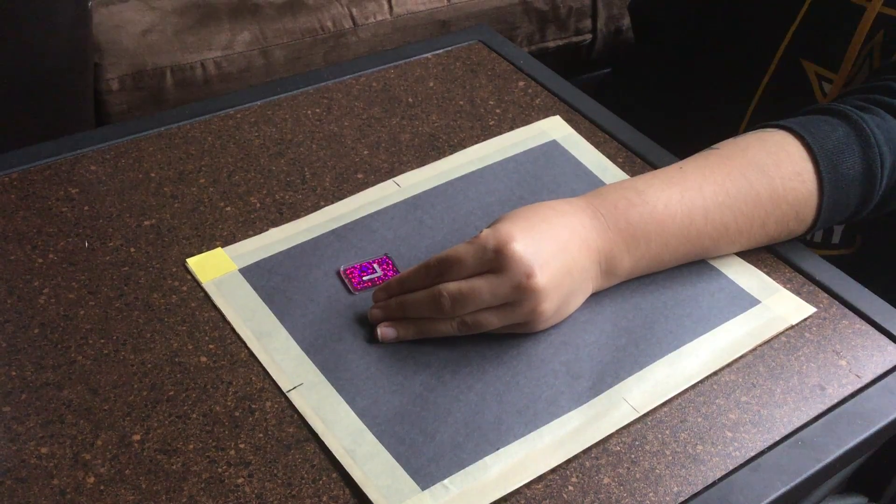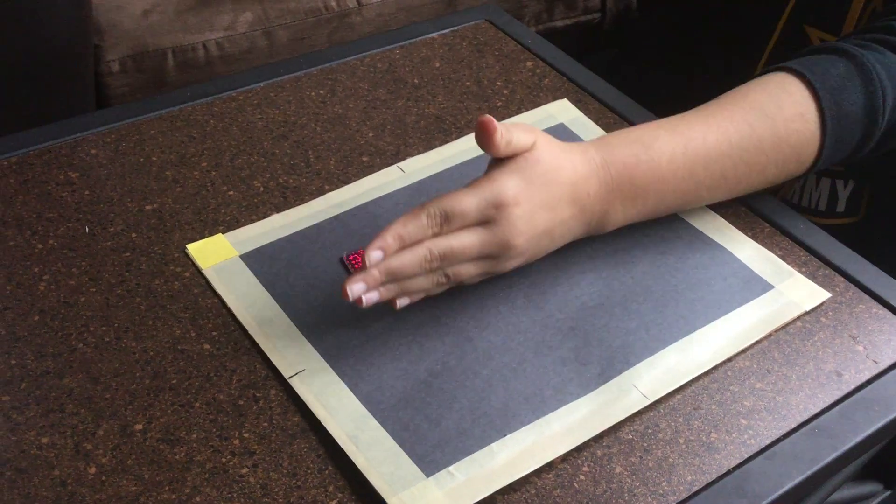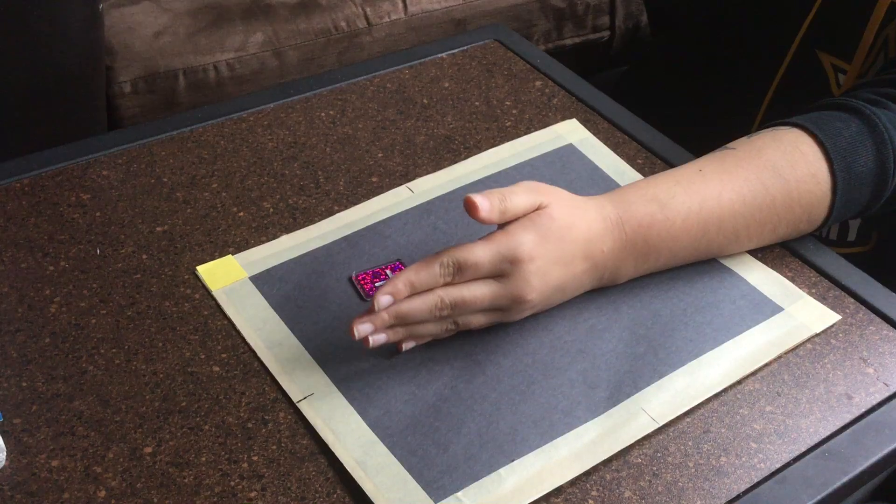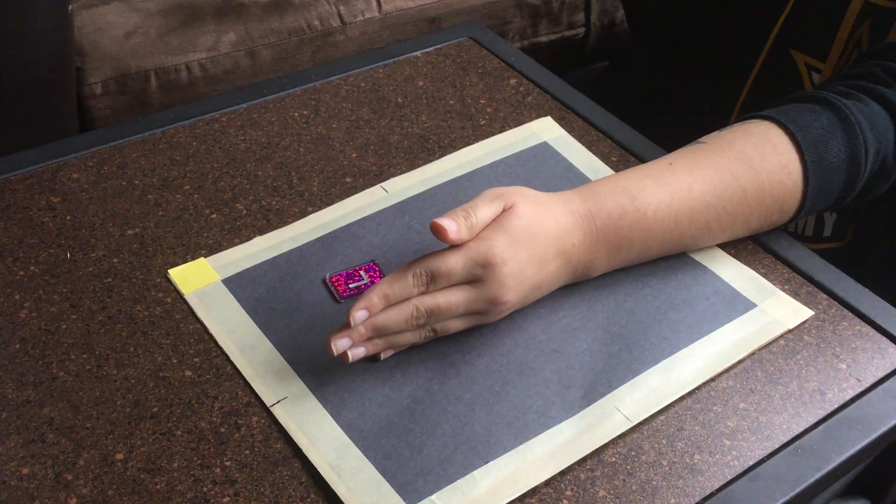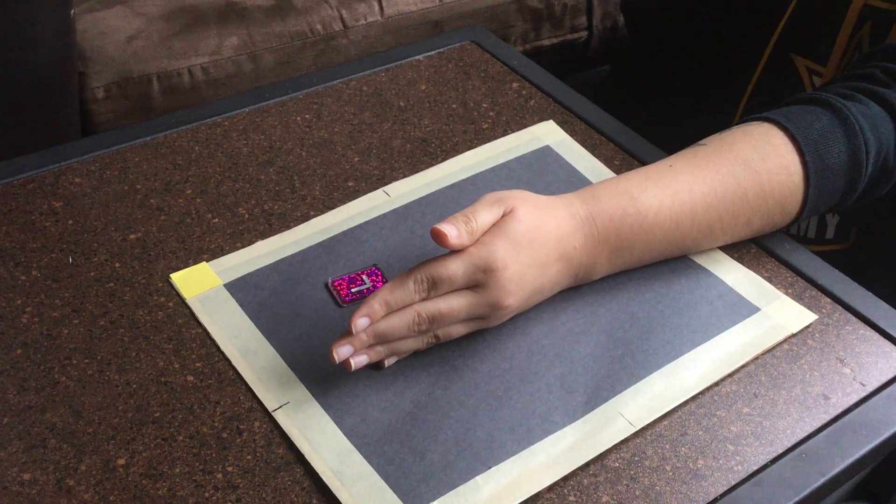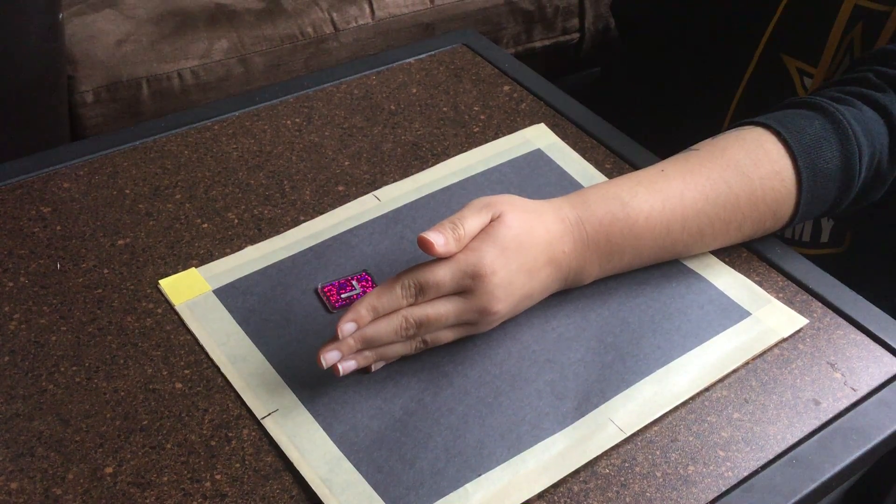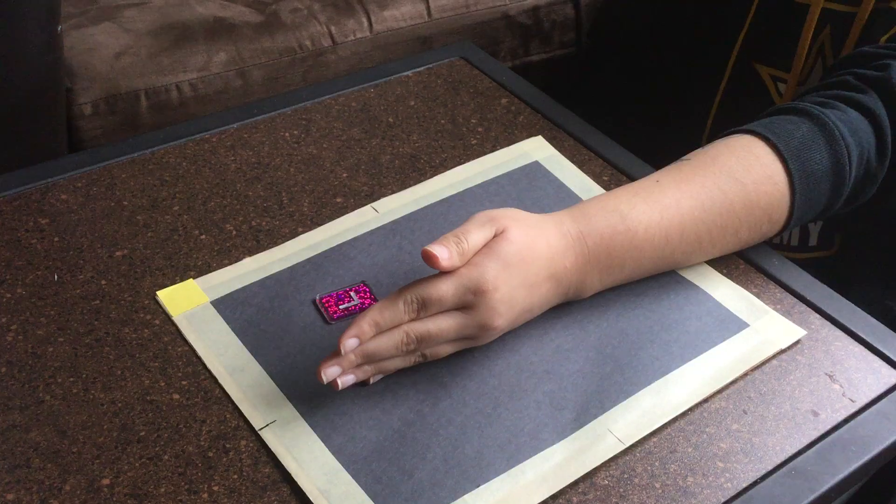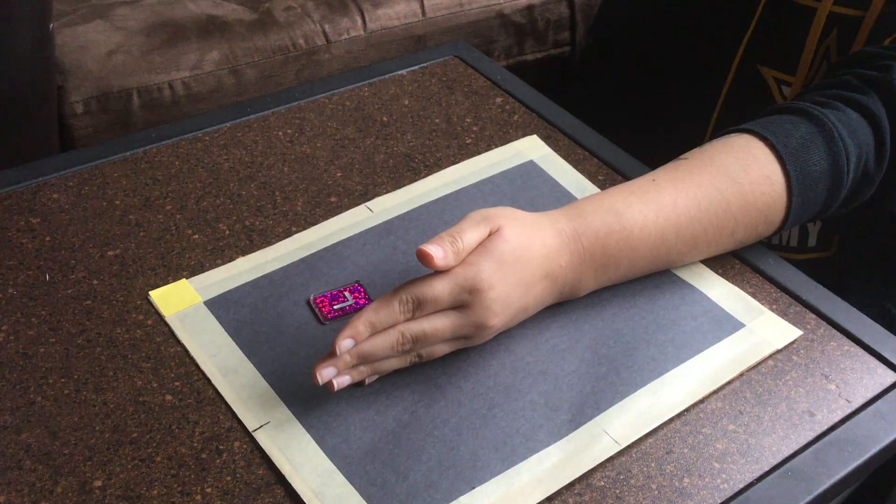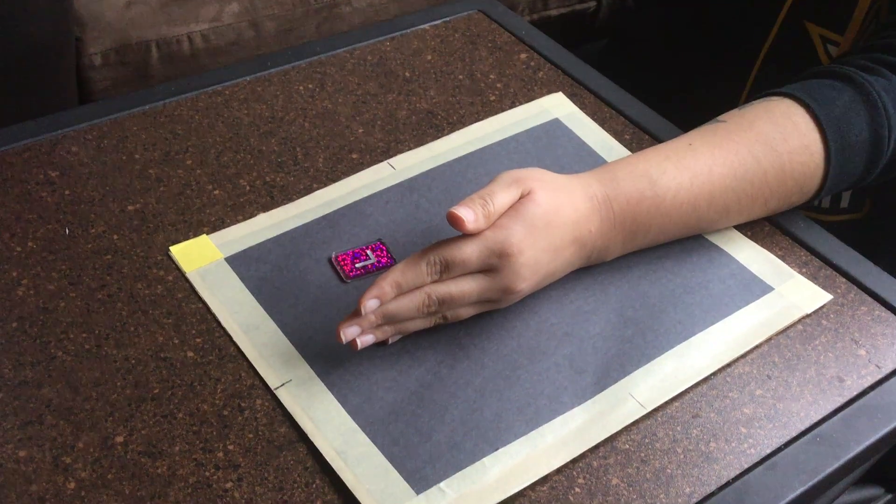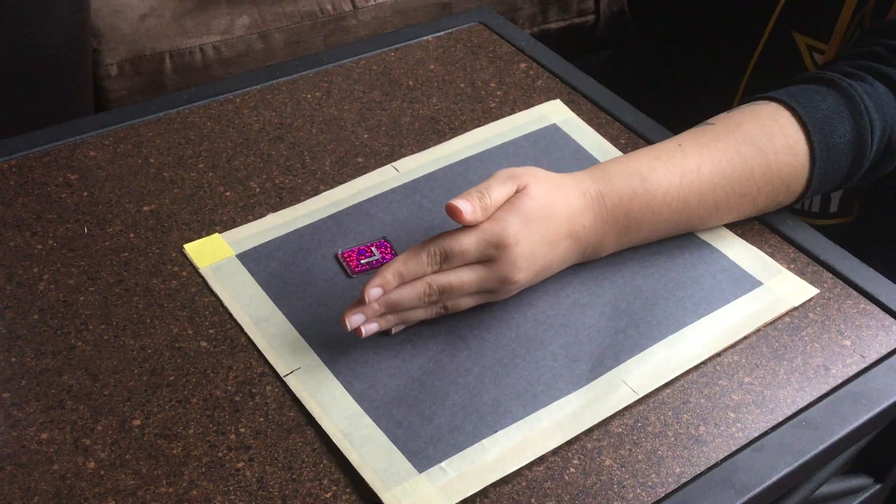And then we're going to be doing lateral wrist. And for the lateral wrist, the central ray is going to be going through the wrist and the collimation is going to be in the lateral metacarpals, the proximal metacarpals and the distal radius and the ulna.